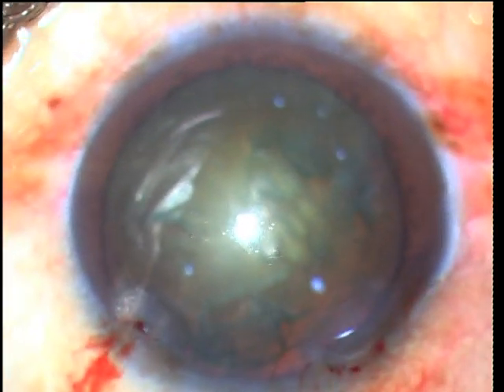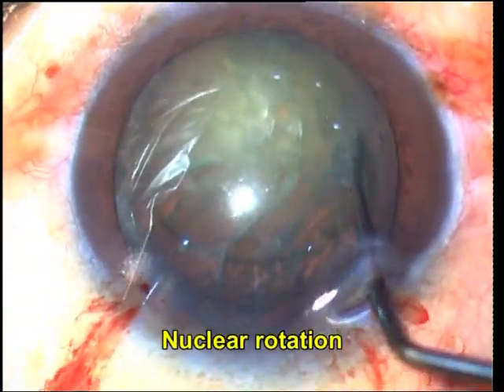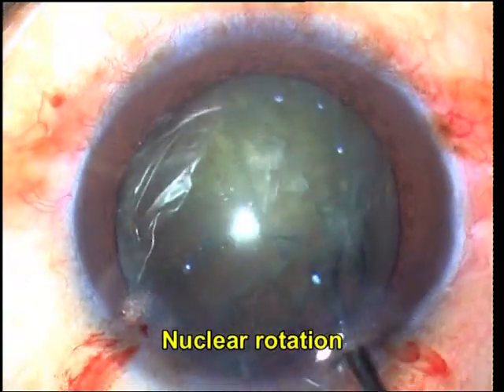Hydrodissection is done and it is made sure that the nucleus can rotate freely. Once the nucleus rotates freely, it is time to sculpt the nucleus.